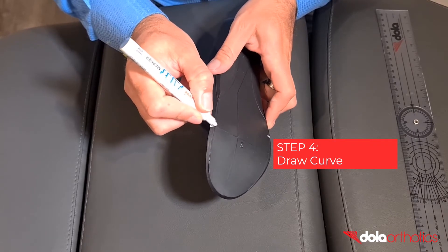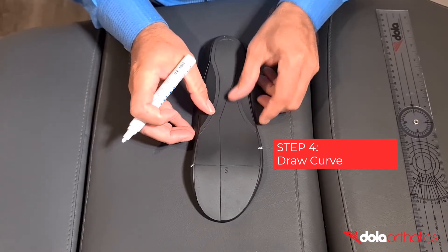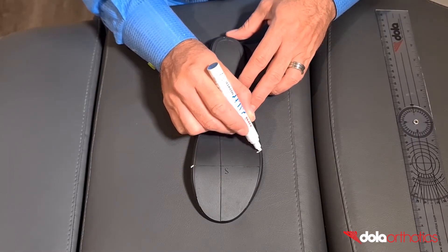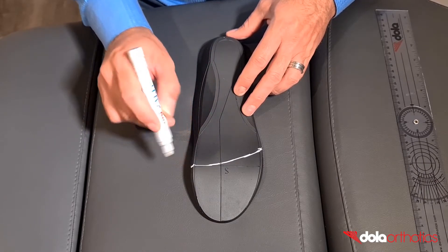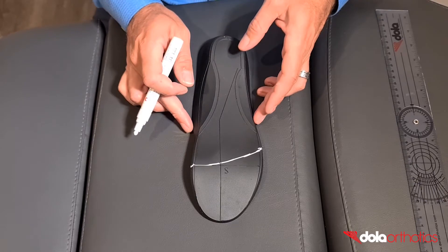Step 4: Connect the two points with a curve to match the metatarsal parabola or shape of the sulcus to indicate the shape of the extension. You now have your toe walker extension marked as a guide.